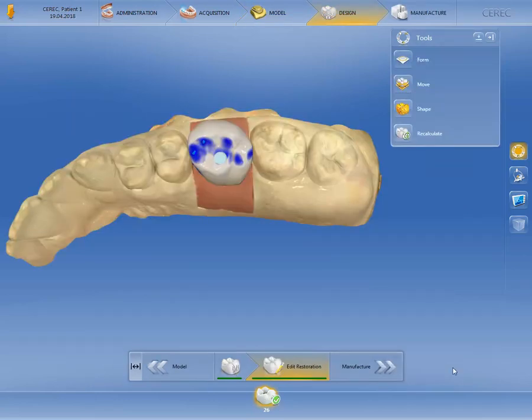Based on the design mode biogeneric individual and the parameter settings, the CEREC software 4.6 has now calculated an initial design proposal. This proposal can be modified as usual using the various tools and functions in the side palette before switching to the last phase, the manufacture phase.